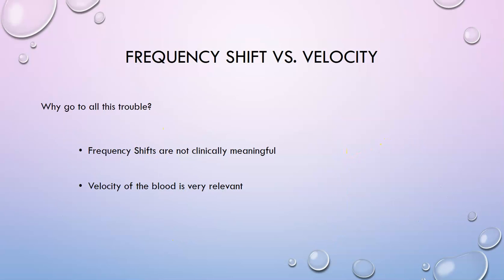So why go to all this trouble? Well, frequency shifts aren't clinically meaningful. We said that. The velocity of the blood is very relevant. So we need to be able to solve for that velocity.